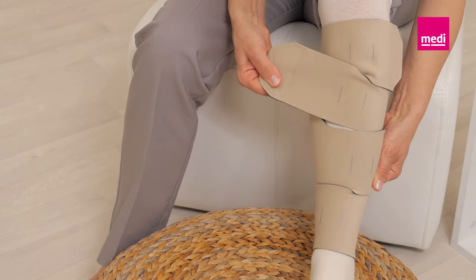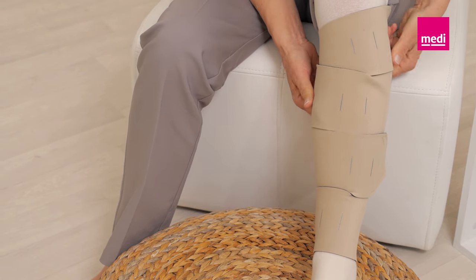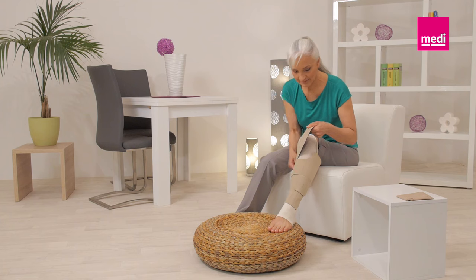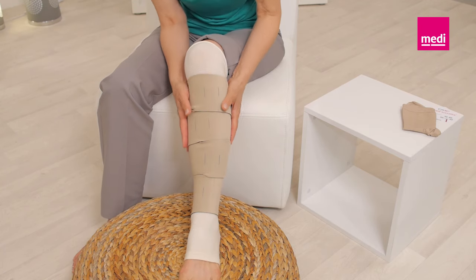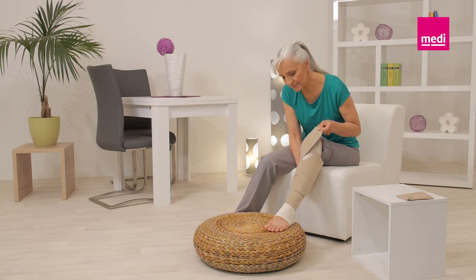Unroll the bottom two bands and secure the bottom band to the outside of the legging. Then, while holding the second band, detach the next band. Secure the second band and continue this process with the other bands going up the leg. The garment should lay flat and wrinkle-free against the leg.